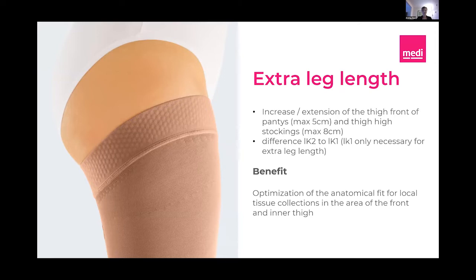So then extra leg length. This is another topic I talk a lot about, especially for women, and especially if you have a little more lymphatic tissue sitting right underneath the groin area, which happens quite often. So our traditional stockings are measured lengthwise right in the gluteal fold. We do not want them measured higher, because the buttocks otherwise would push down the band and flip the band over, and the garment will start rolling.